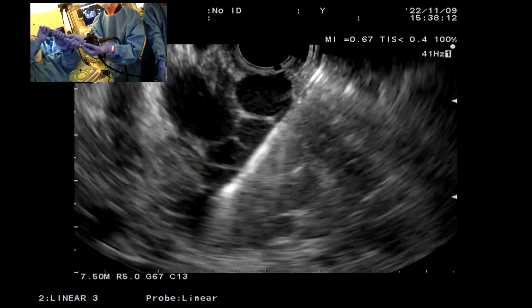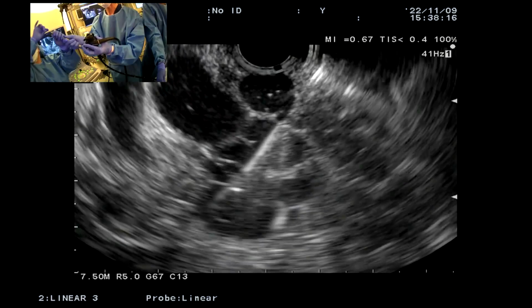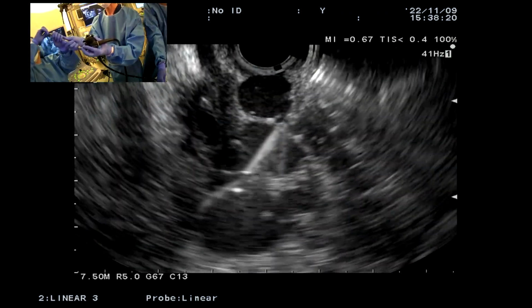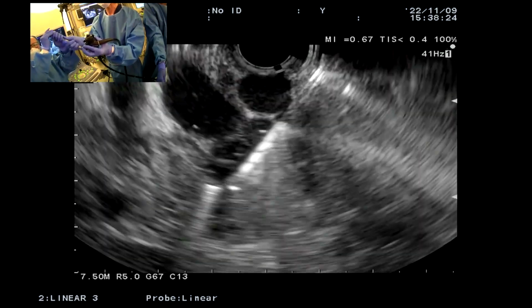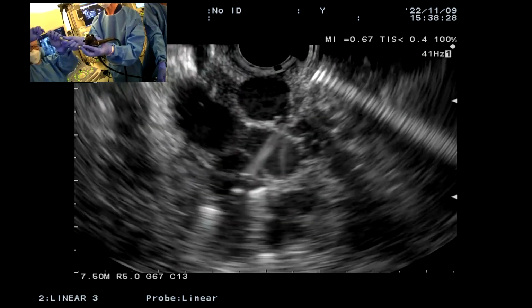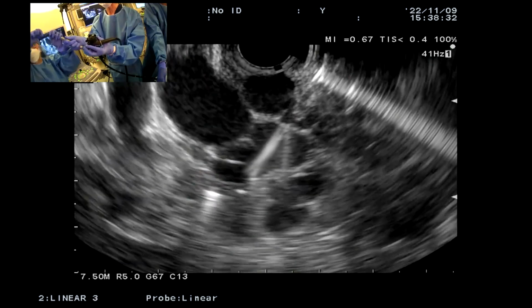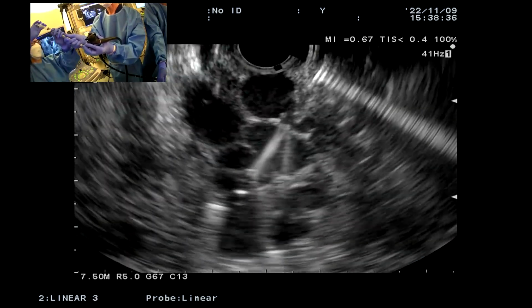So the assistant's holding the scope nice and steady. You see it coiling very nicely inside the varix. Very good. Continue pushing out, and it pushes out very smoothly. This goes very easily until it all goes out. And now we're going to remove the stylet, which we use as a pusher to push the coil out. And now comes our second coil. We're going to aspirate first to make sure that's fine.